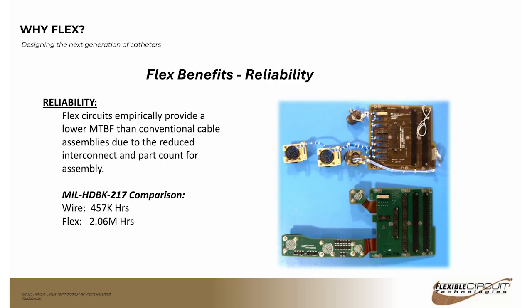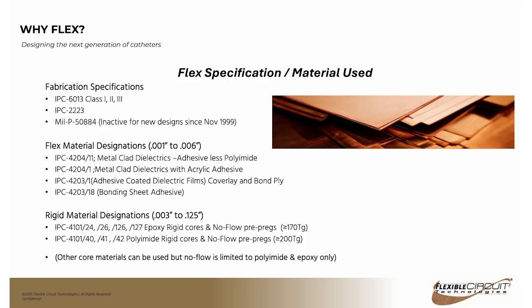If you look at reliability, and this is pretty much in any system, whether it's your house or an electronic assembly, the failures rarely occur in the middle of a run. It's usually where you have solder joints or wired connections. And flex circuits can eliminate a lot of those because all of your conductors are on a single substrate, and so you don't have all of the individual connections that are prone to failure. I'm going to be going over this a little bit more on the cost drivers later on.